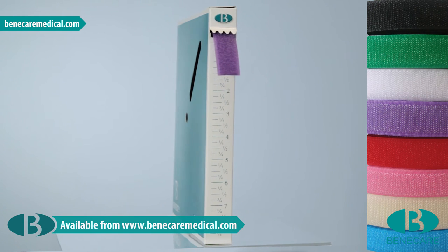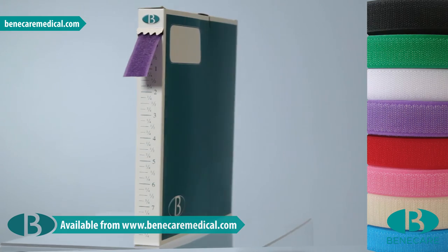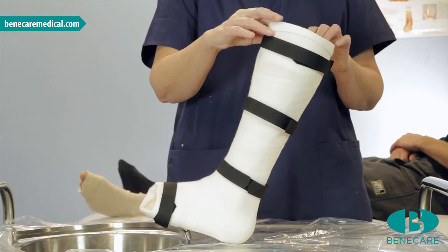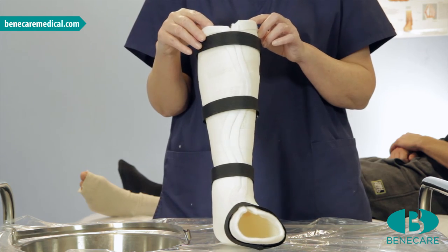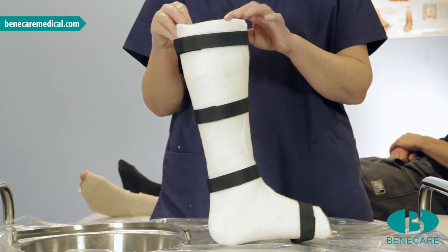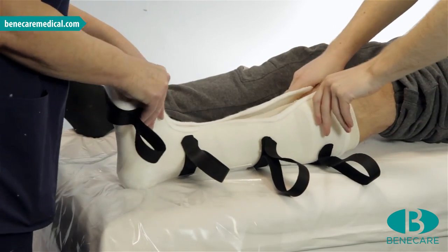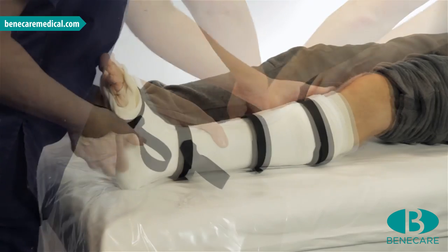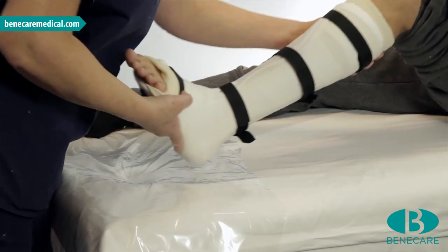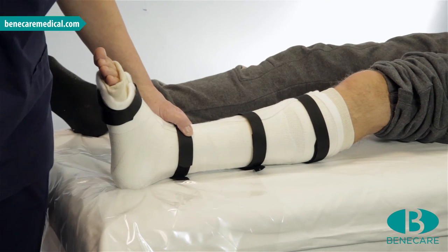You are now required to apply four pieces of adhesive hook and non-adhesive loop — one on the distal aspect of the foot and three spread evenly along the leg. Re-apply the cast and check it is a perfect fit. Ensure it does not cause constrictions and is comfortable for the patient.